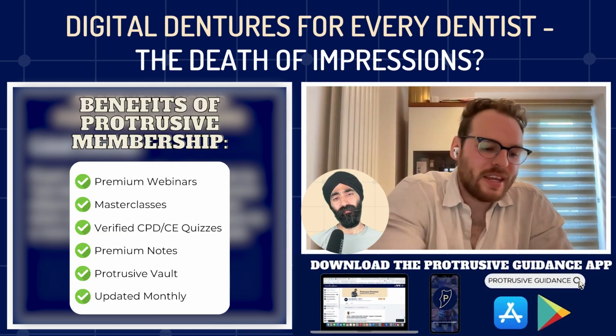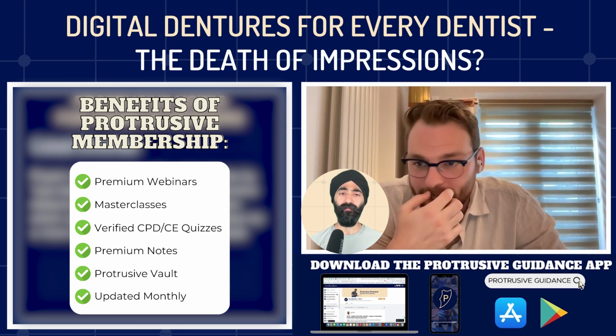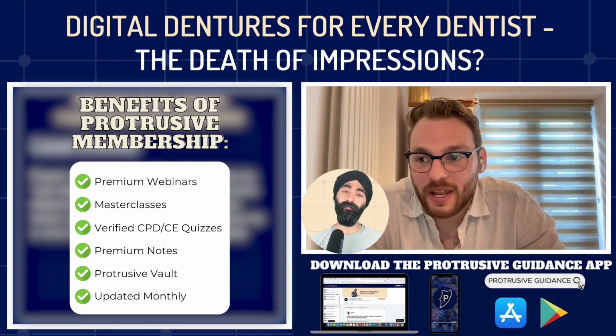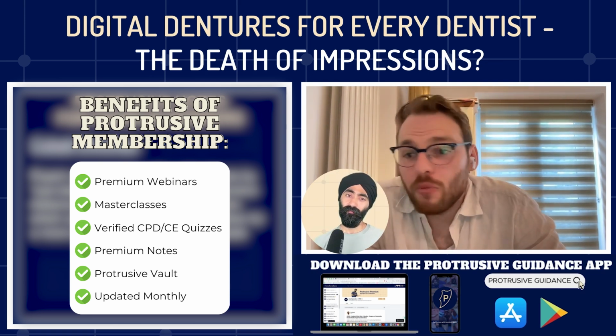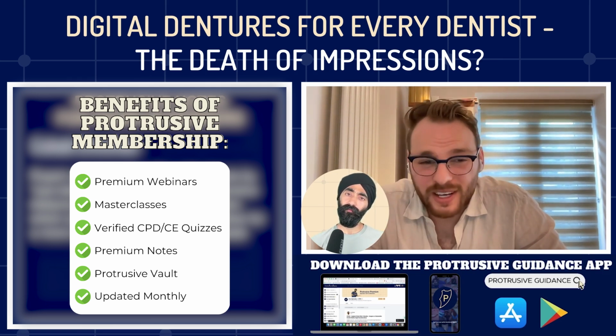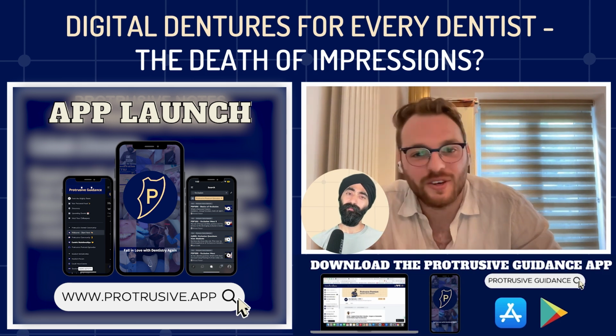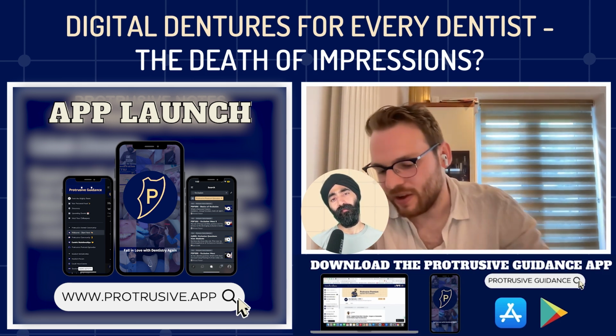Yeah, either just making it out of sort of an acrylic, or you can get some printed obviously now. Those are really handy just to make things more efficient for you and more accurate, because if you've got the data, and at the moment with especially things like the printed, it can take seconds to actually get it made and cost pennies, so why not do it? I think they're really, really useful.